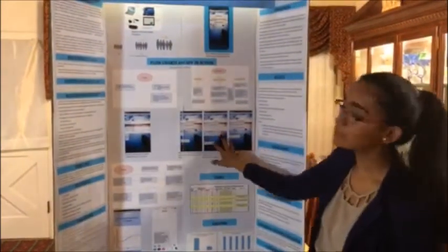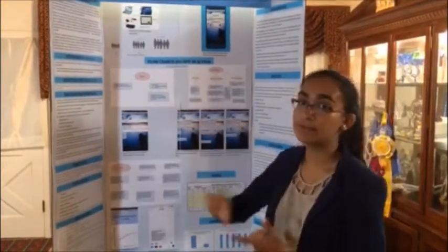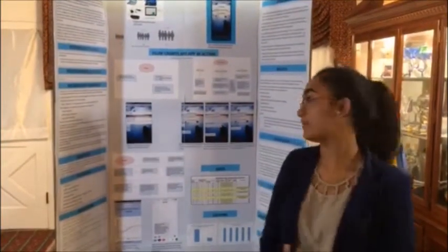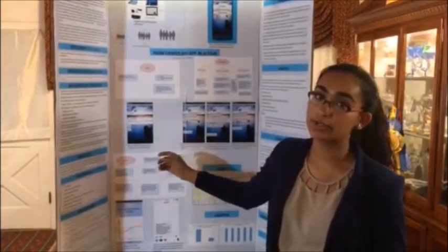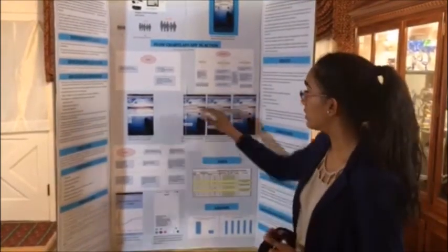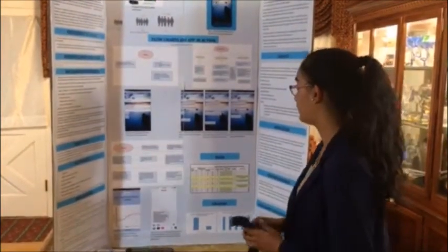The customization screen is more user preferences rather than emergency information, where users can pick the song that they use to calm down, because once again, not everyone can calm down to the same type of music. It depends on the person. Then you have an option to change your heart rate device. Say you have a new heart rate monitor and you don't have to go into the code to change it this way. You can just click and that will scan the area for the available Bluetooth devices, and that's how you can connect to your heart rate monitor.